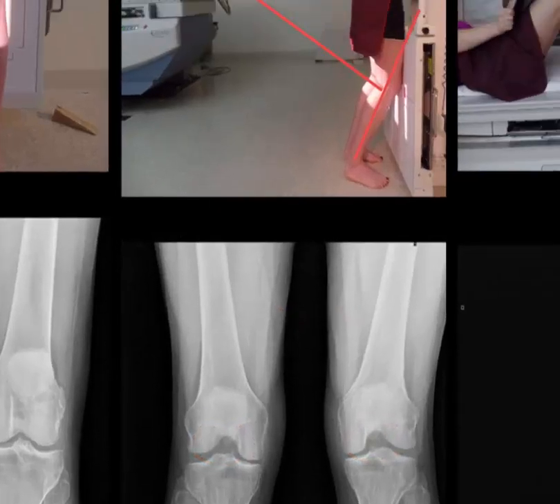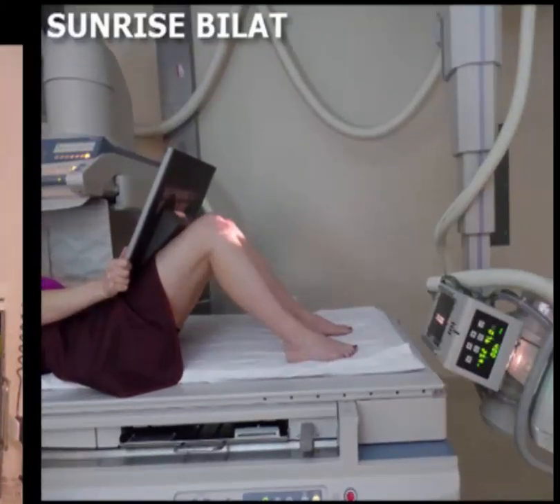Now, let's move into the sunrise. Here, we will have the patient lying supine on the radiographic table. When having the patient lay supine on the table, ensure that the patient is rather comfortable. This may require additional pillows or supports behind the patient's head and back. Next, have the patient gradually flex their knees, similarly to what is seen here.